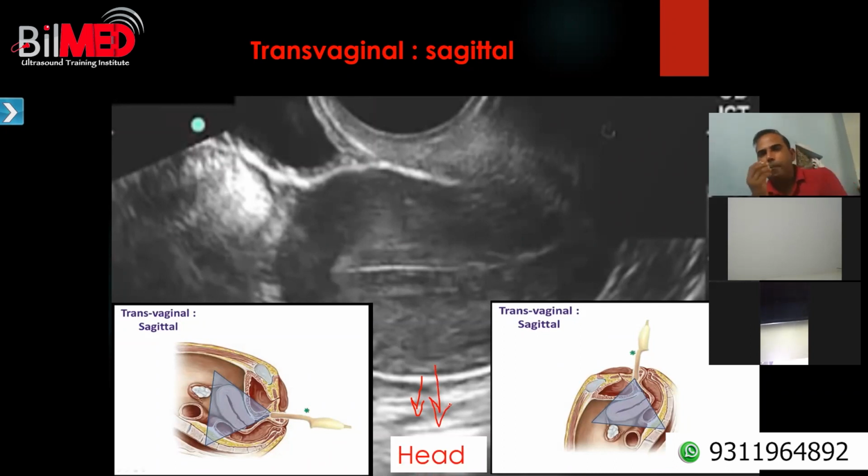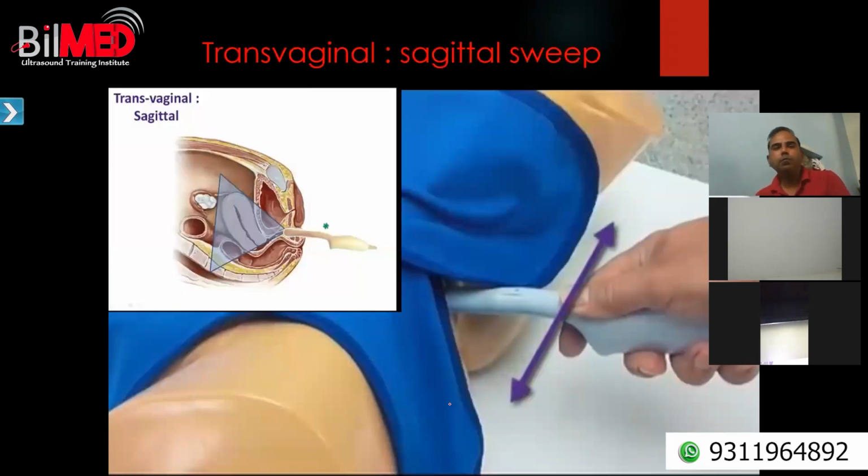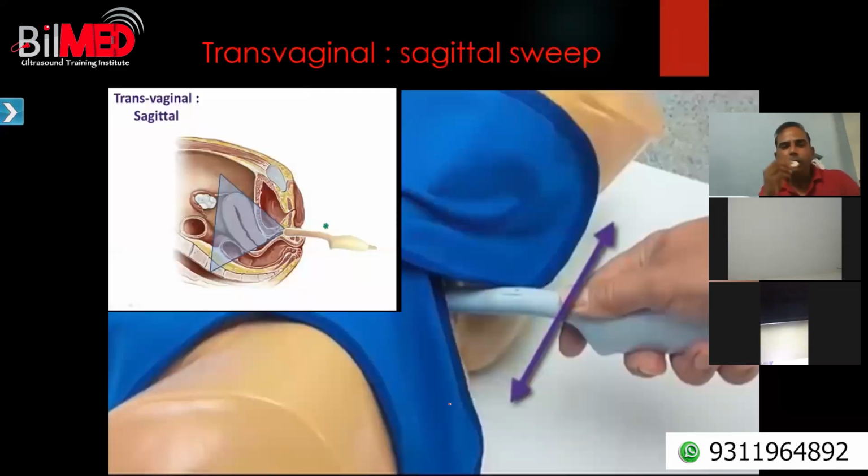I am not talking about the image. So the point here is that when you are inserting, you should know that. Now see, this screen orientation alone will take me about 2 hours, and in our server-based class, it is taking more than 2 hours.